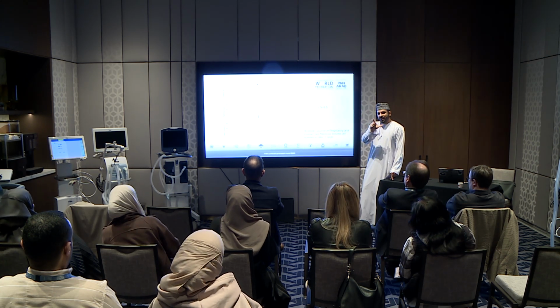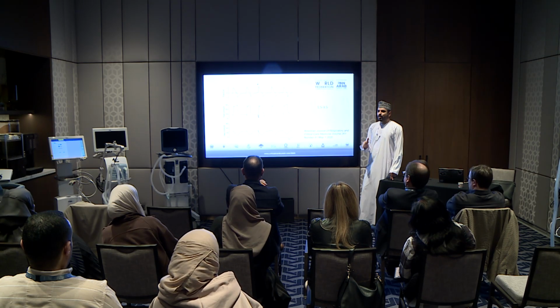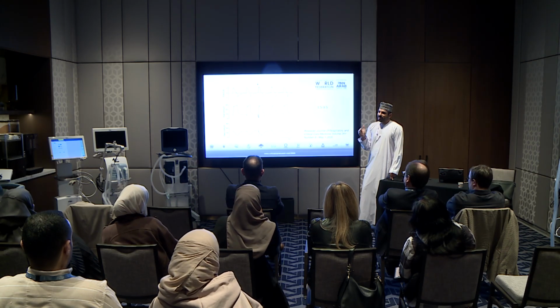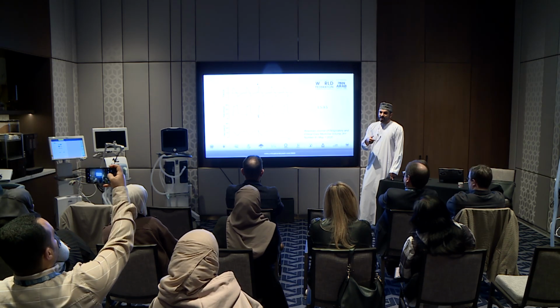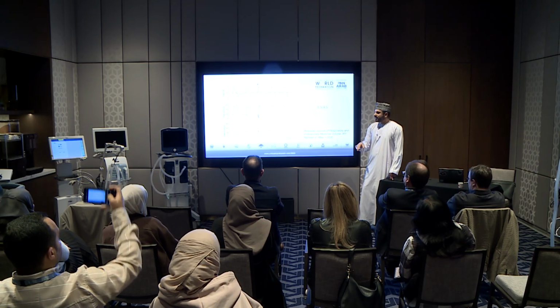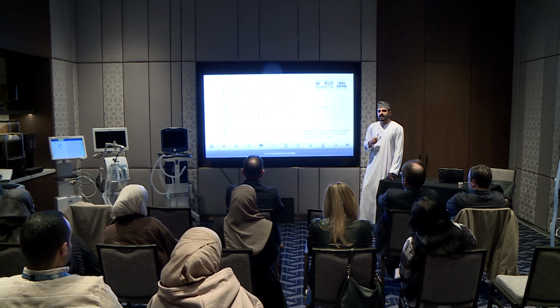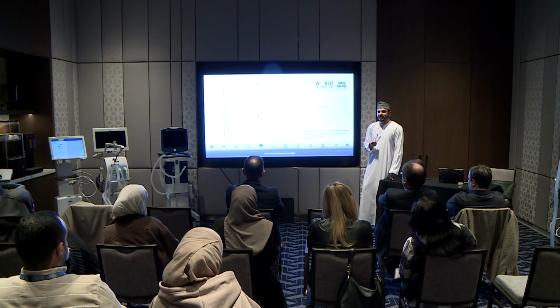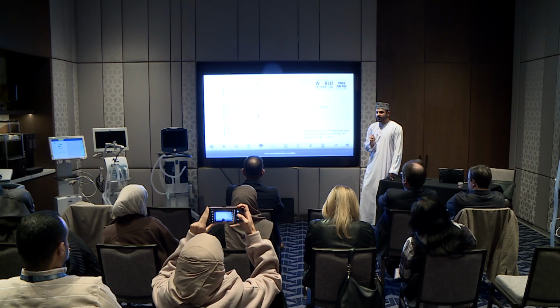From those studies, we actually have a reference range. What is a safe occlusion pressure? It's between 1.5 and 3.5, or minus 1.5 and minus 3.5. If it's less than 1.5, so it's like 1 or 0.5, it tells you maybe the patient is over-sedated and does not have enough neuronal input. On the other hand, if it's more than minus 3.5, it tells you that the neuronal input is extremely high. The patient is at risk of developing patient self-inflicted lung injury.